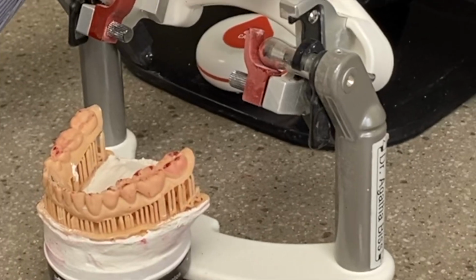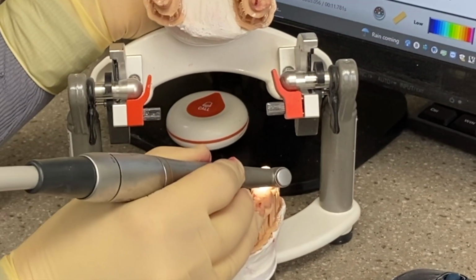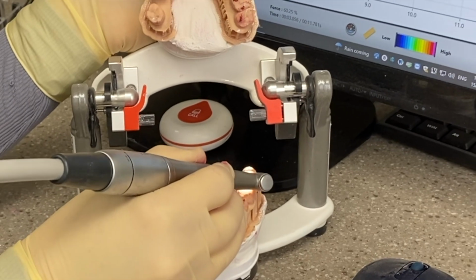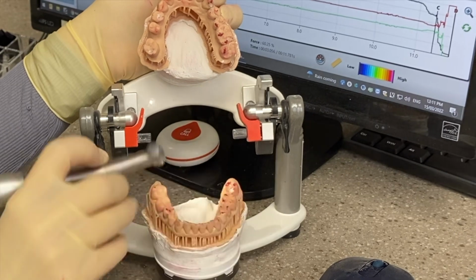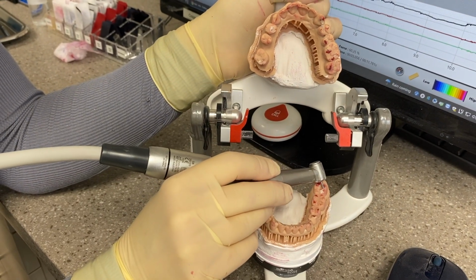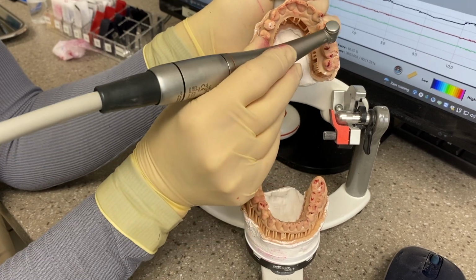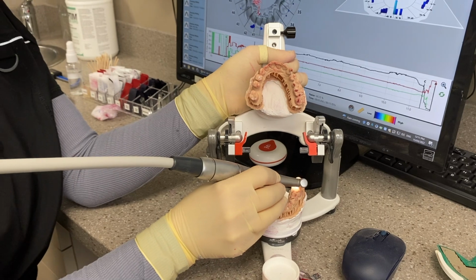Not a fan again of inclines. So we're gonna take that out and create a groove for that upper to kind of slide into. And you're gonna leave the contact. You wanna leave this little tiny contact. That cusp should be in occlusion with the central fossa here. We just wanna take out the incline.